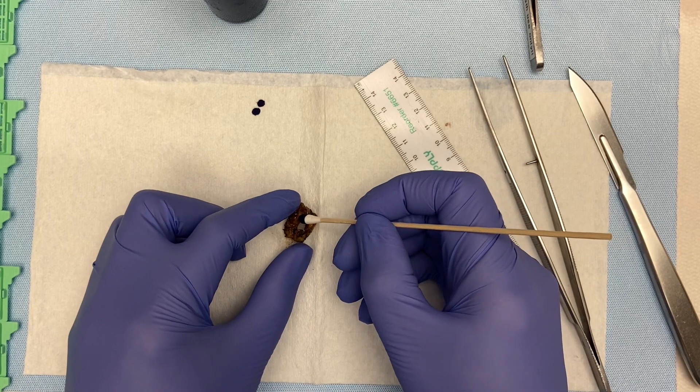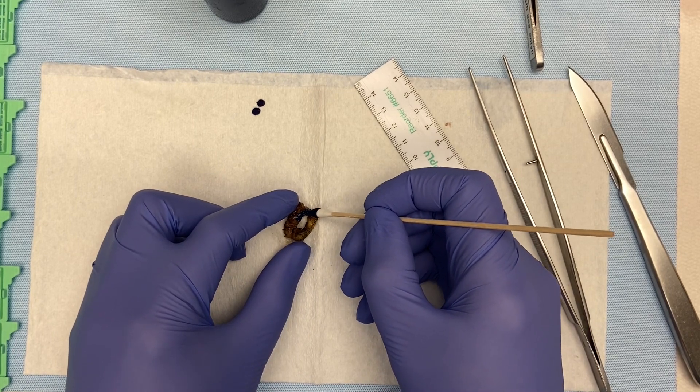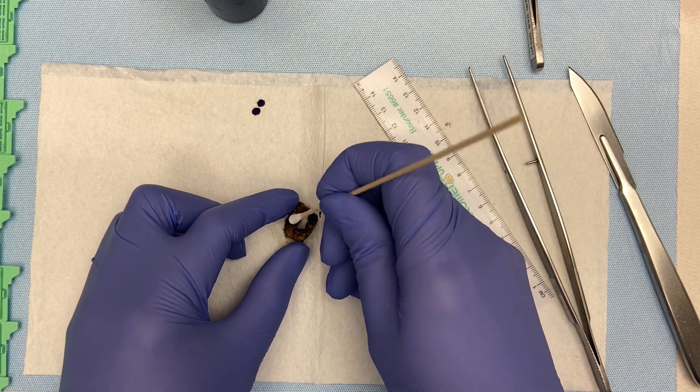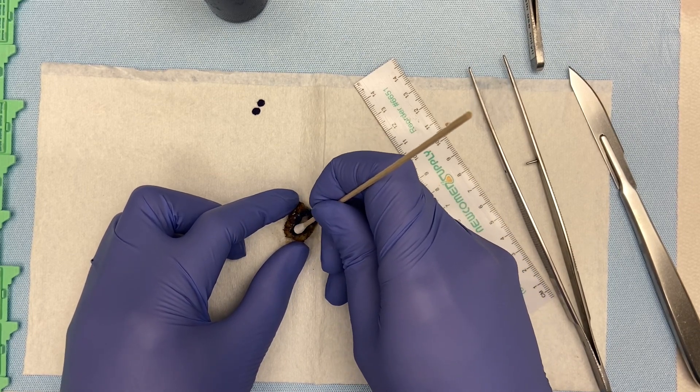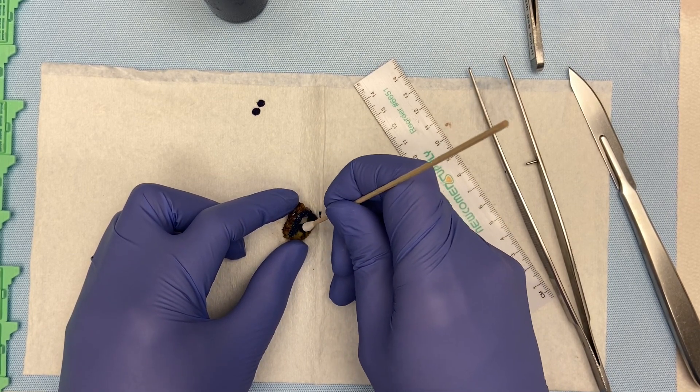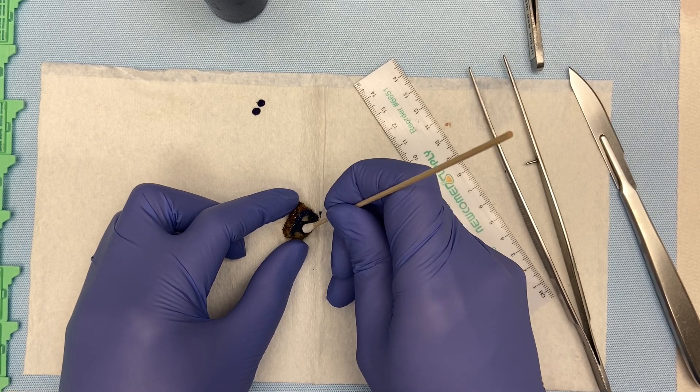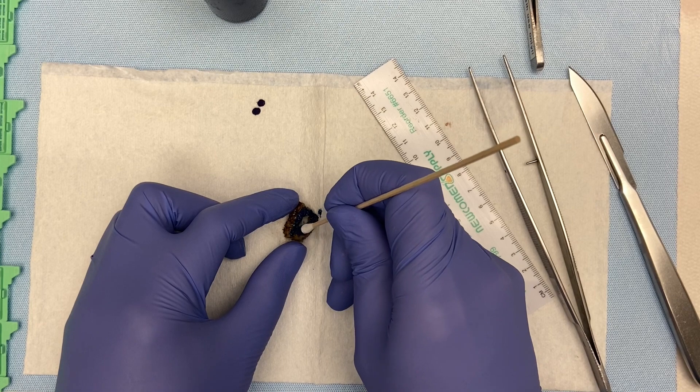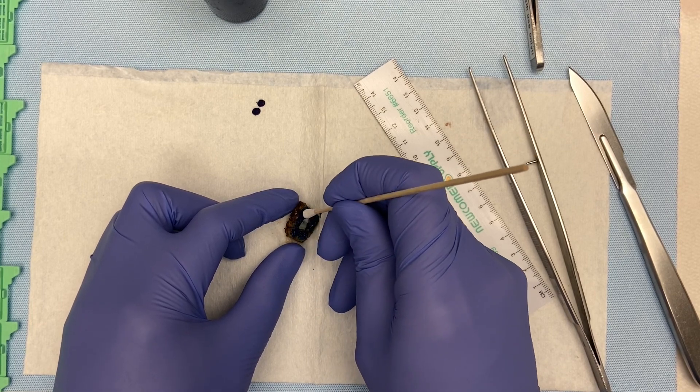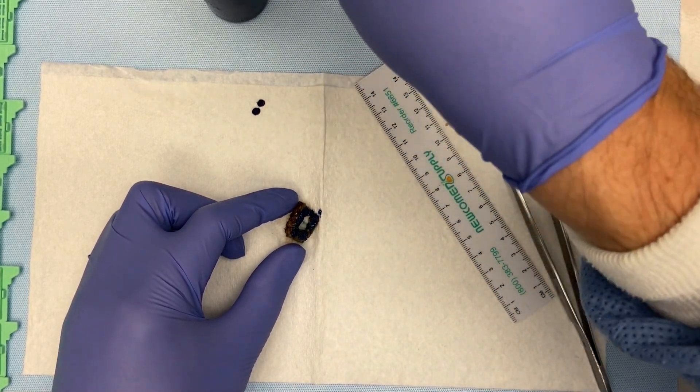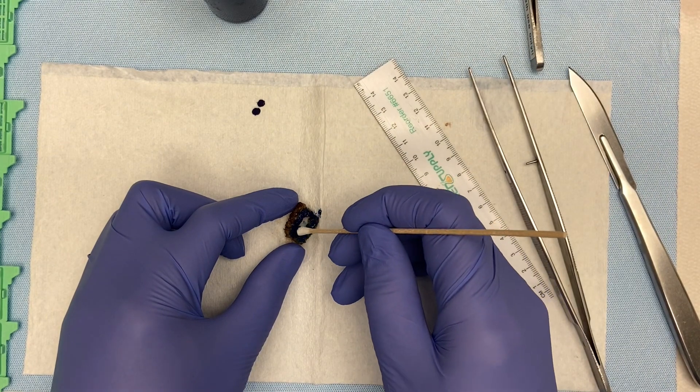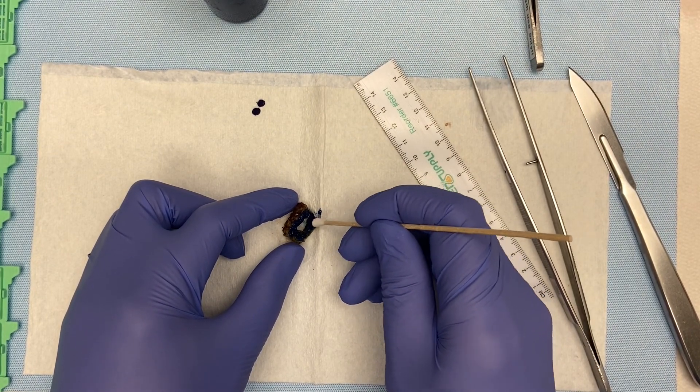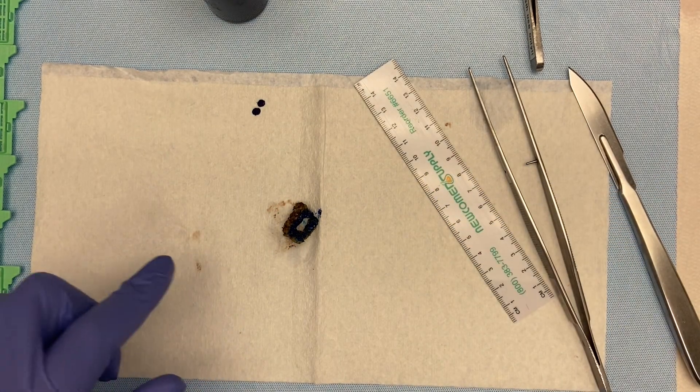Okay, so the inking is basically, I'm going to ink blue on the endocervical area, which is the inner rim of the hole, and then I'll ink black on the resection margin of the remainder of the specimen. When I take my sections, what we're hoping to do is get a representative of the blue and black and the mucosa all in one section every time.